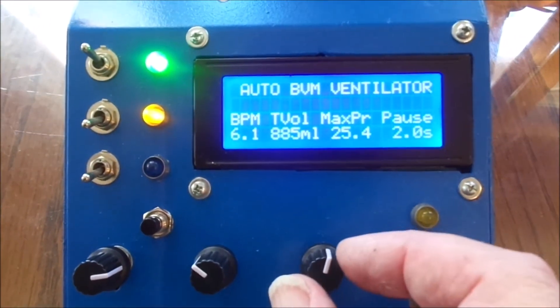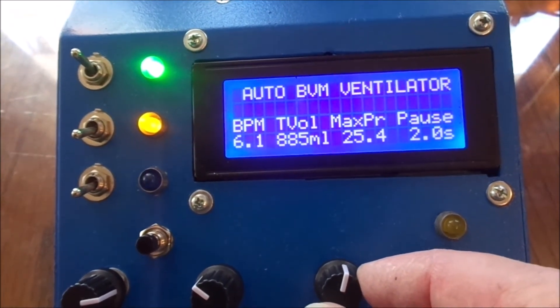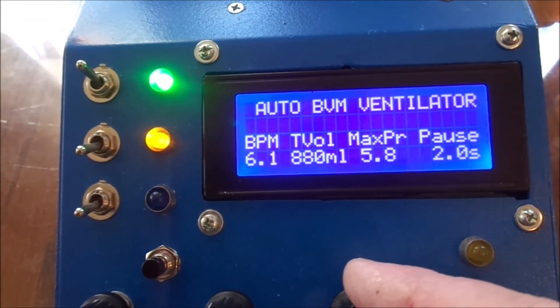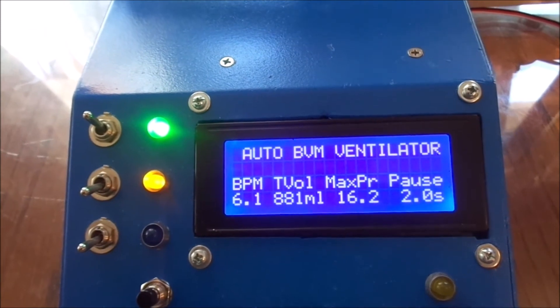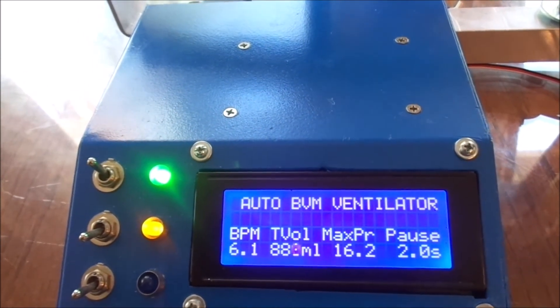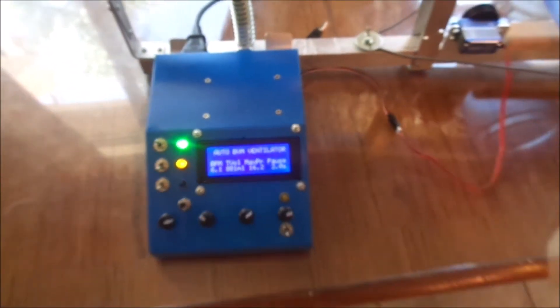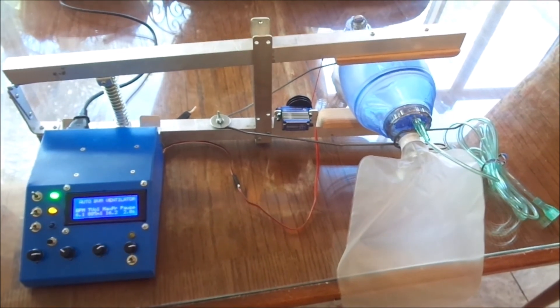This knob sets the maximum lung pressure allowed, in centimeters of water. This knob sets the amount of pause before it starts each stroke. If it detects the patient starting to breathe on his own, it will back off and let the patient do the breathing without the machine helping. If the patient doesn't start breathing within the number of seconds indicated, then the machine takes over.